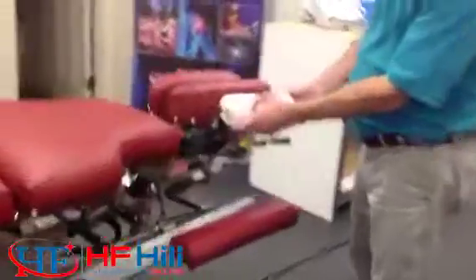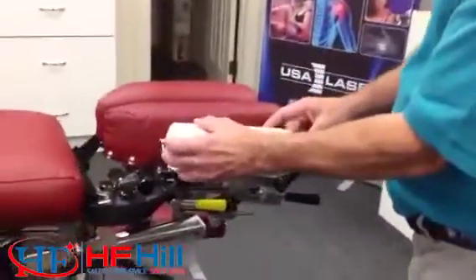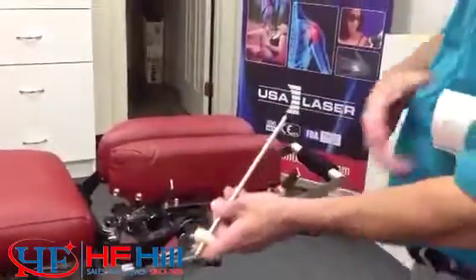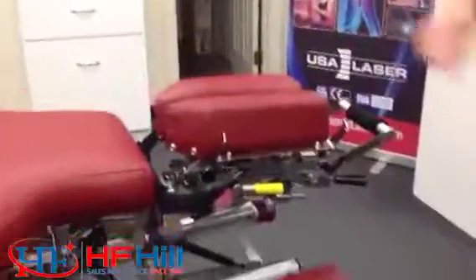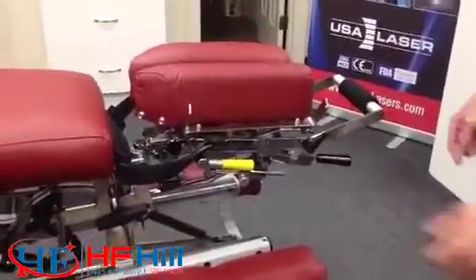We're going to start with the paper attachment. It is a spring-loaded paper attachment that is easily taken on and off, and for the sake of this video we're going to leave it off so that we can see the functionality of the table really well.